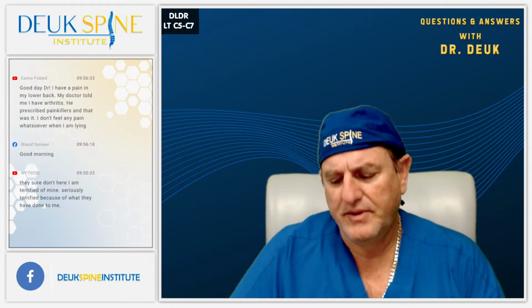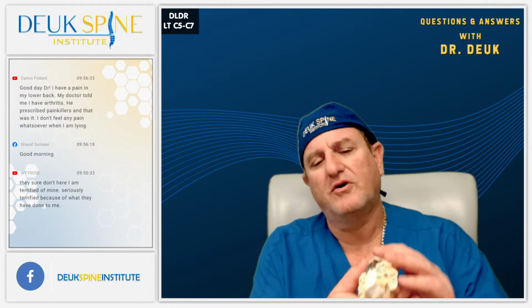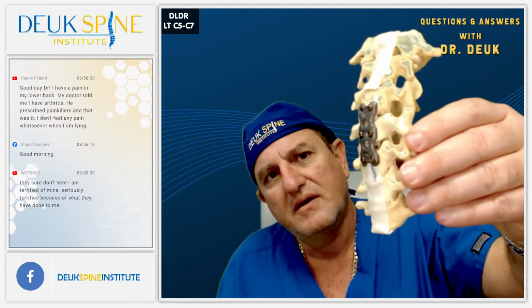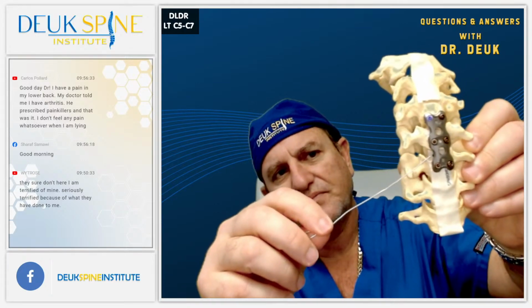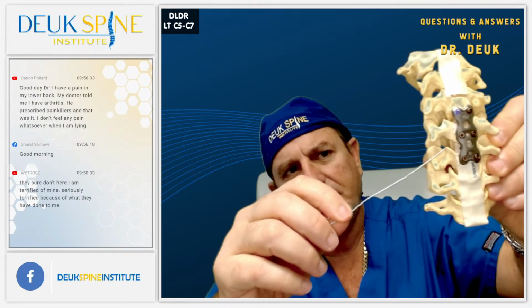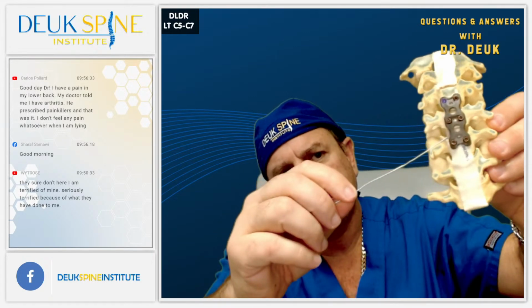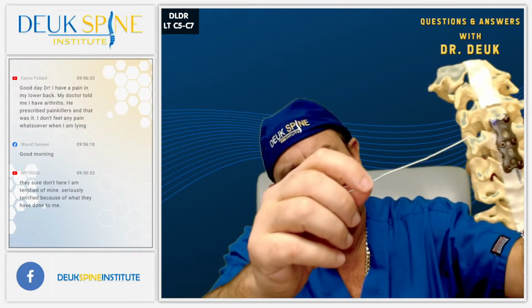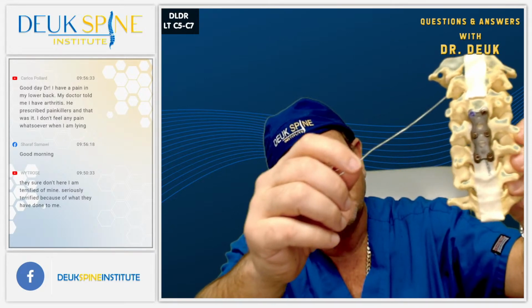And rather than doing a fusion surgery, which involves going in and removing the entire disc itself and getting to the herniation in the back, putting in a cage made out of plastic or PEEK, it's really carbon, but we call it plastic anyway. You can see that cage right there. And then putting a metal plate over it. So this patient would have had 2 discs removed, cages and a metal plate.